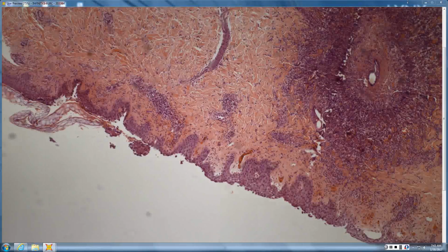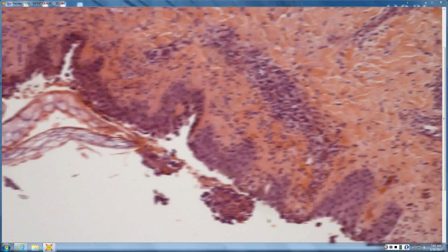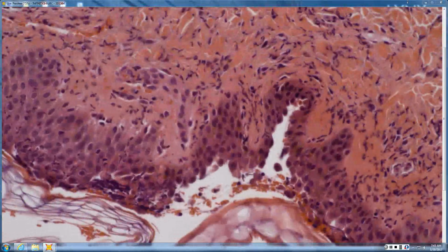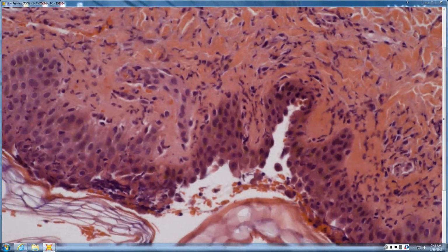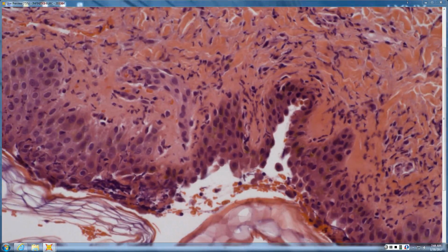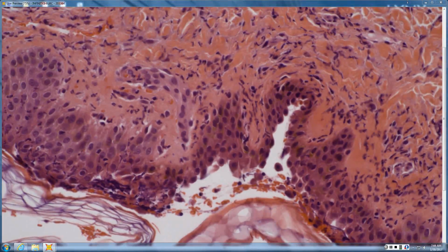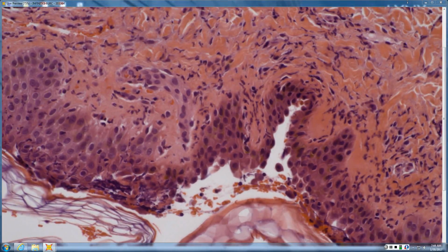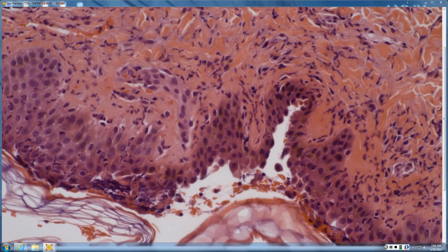Furuncle, yeah. And then tell me about the overlying tissue. So you've got a furuncle, and then what's going on overlying? Yeah, so you have some subcorneal split, and acantholysis. It's almost like a staph scalded skin kind of picture again. So you have a furuncle, and you have at least locally produced exfoliative toxin. And then if the person is a kid or an adult with bad kidneys, then that'll go on to exfoliation all over.